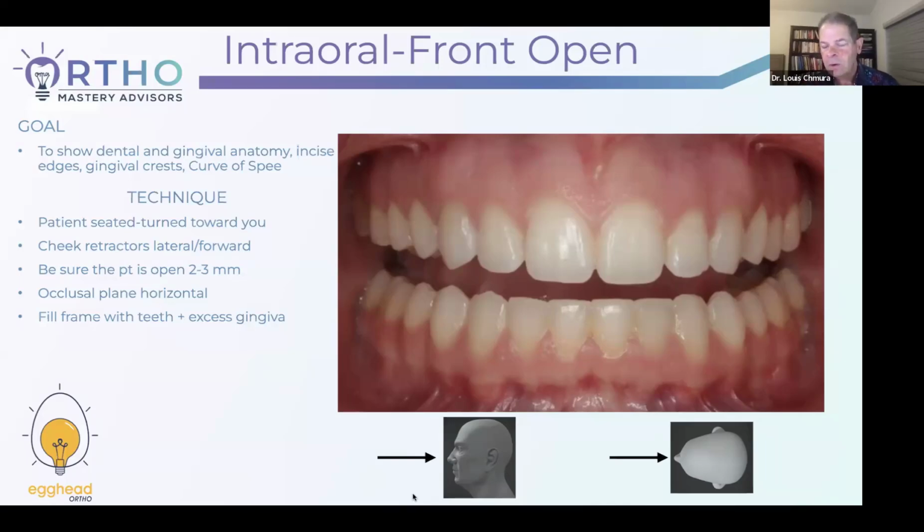That sort of thing. You look at the lowers, we didn't do what we call the Hollywood treatment on those, where we reshaped them to look like teeth, but we did do it on the uppers. And there's a whole science to that. Probably do another lecture on just that, okay? Where the radius in the middle is a little less than the next radius, and so on. There's a whole science to it, and the heights of contours of the gingiva. Bottom line is, this one is really to show the incisal edges and to show if there's a really large curve of Spee.